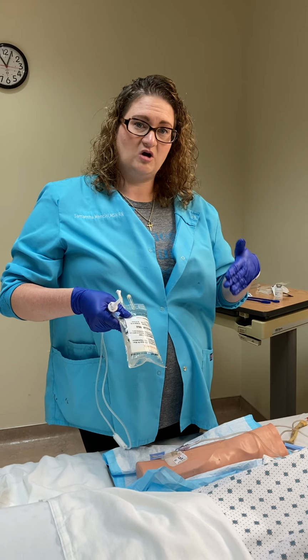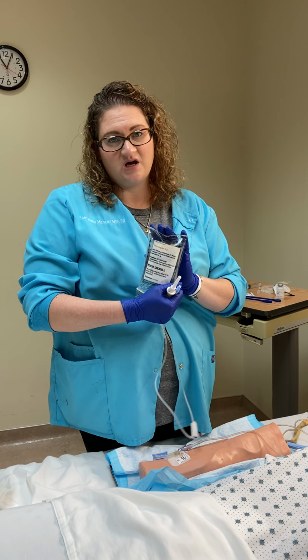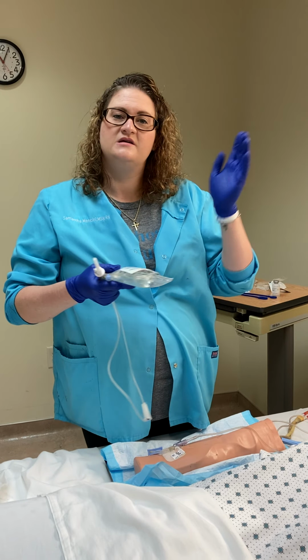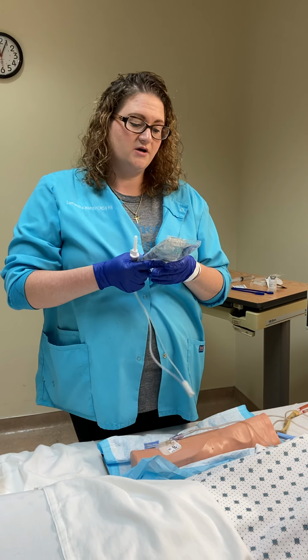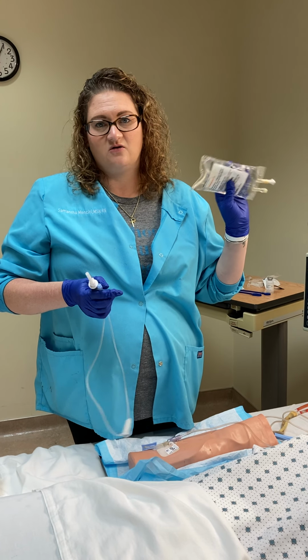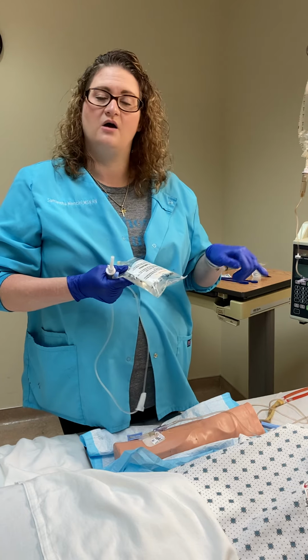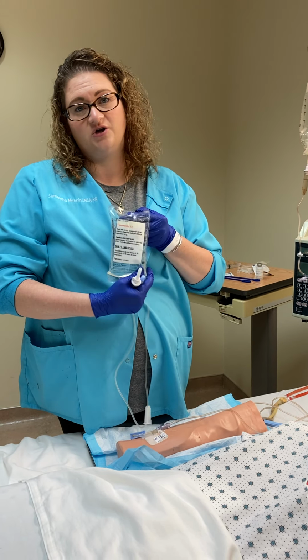Sometimes it's listed in the MAR. For 1 gram of Vanco, this is 200 mLs, and we have the option to run it over 60 to 120 minutes in the drug book. So I'm going to choose to run this over 60 minutes. So I'm going to do 200 mLs per hour when I program it into my pump with a volume of 200 mLs.